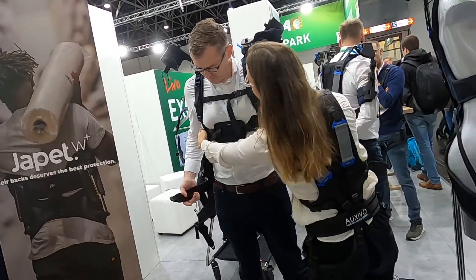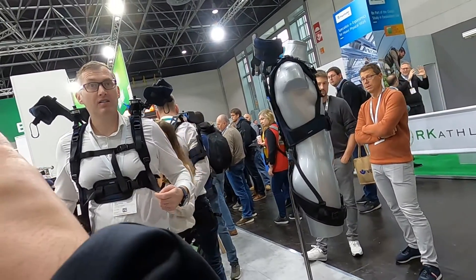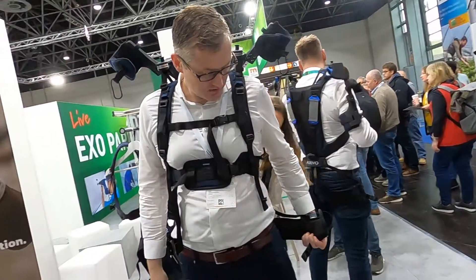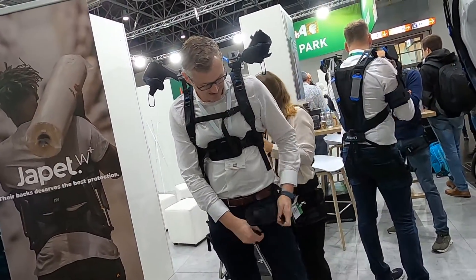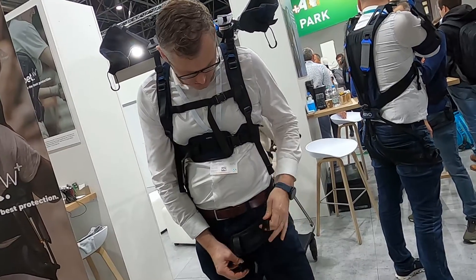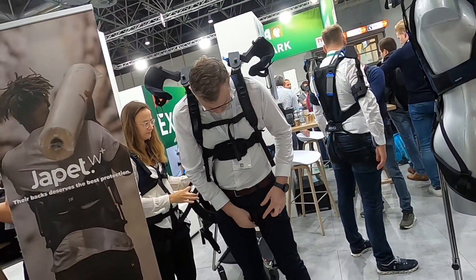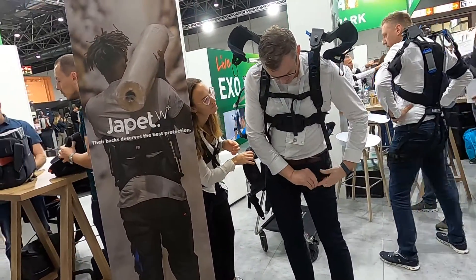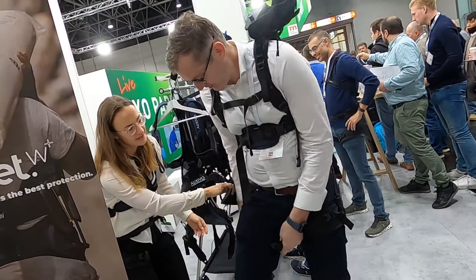We also have these two straps that are already very tight for you, so that's fine. They're meant to be tighter, like in sport. Yeah, it should be tight. It's also a bit easier to have an idea of the fit that way.